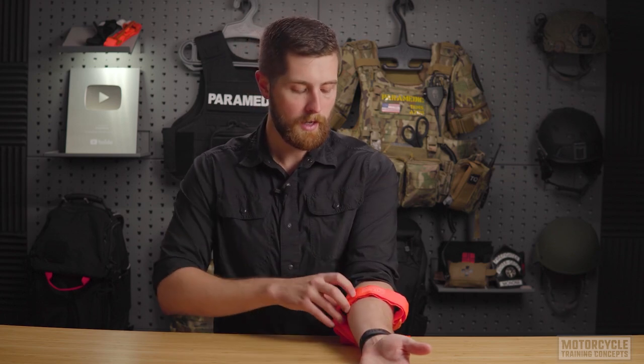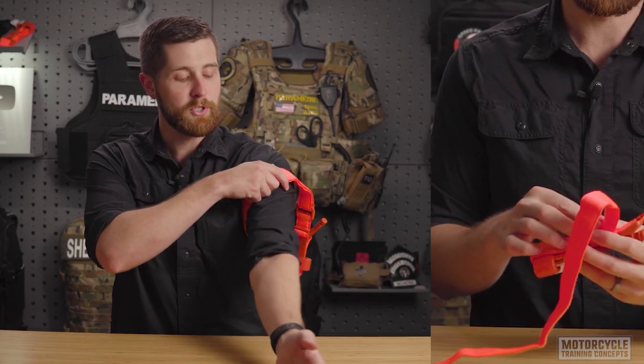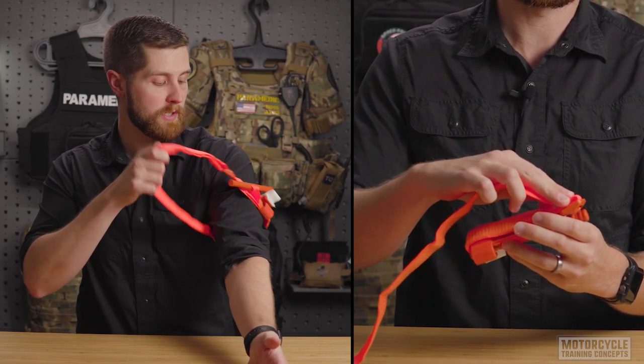If I can't see where the bleeding's coming from — whether there's too much blood or they have a long sleeve coat on — I can take this and put it high and tight on the arm. Proper staging is a must for self-application.